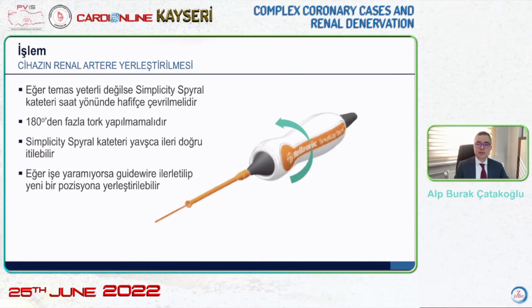So we have to position the catheter better. For that, we have to use a clockwise rotation. Without torquing more than 180 degrees, we circle it, and we pull it upwards and downwards, and we can be pre-positioning without having a new guide wire.